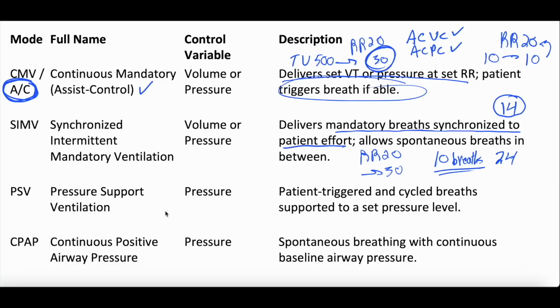This is a mode we often use when we're trying to see if a patient can be liberated from the ventilator or extubated. You'll put them on a pressure support trial. Now, there is usually an inspiratory pressure, and this is an important concept. It's a little tricky, and again, this is just an introduction to the nomenclature. But on a pressure support trial, you will have a PEEP. Remember, a PEEP is a positive end expiratory pressure, and that PEEP is typically 5.